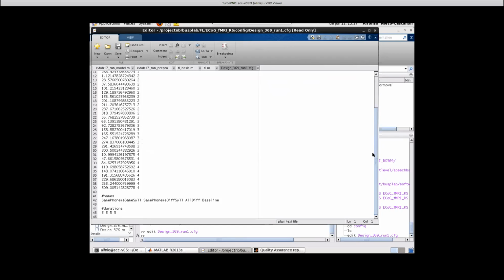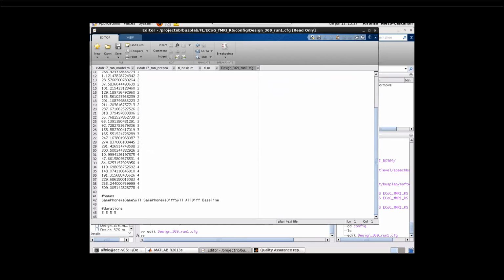Oh, right. Yes, and let me actually double check, because I know SPM 12, some of the new releases have actually changed something about that. So I need to double check. Typically the way that at least our processing pipeline does it is that when you do a slice timing correction, every slice gets corrected to the mid slice, and the mid slice is the actual mid time slice.